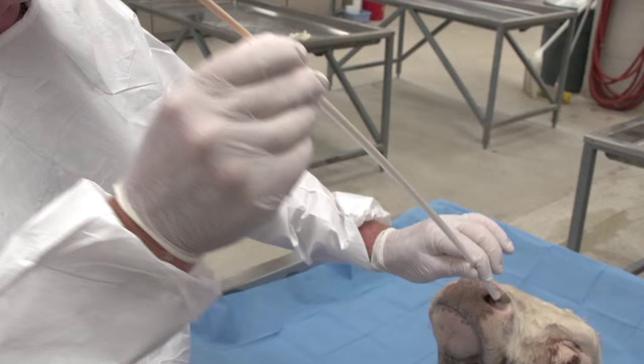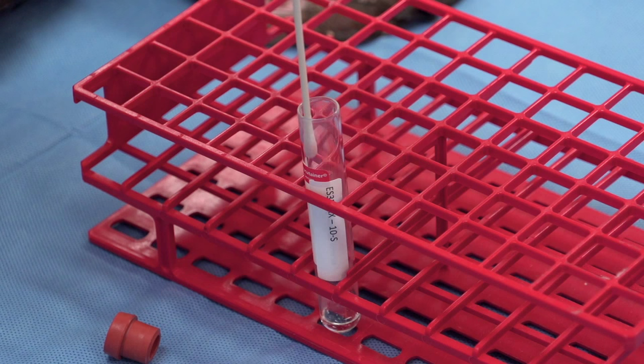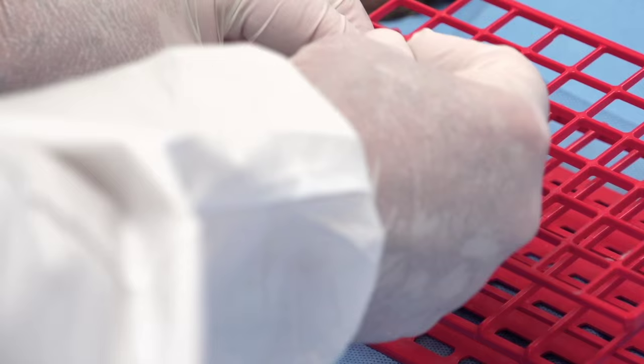Once the sample has been collected, pull the swab back into the guard and remove the entire device. Drop the guard and place the swab in the media container, and cut with the scissors at a length that would allow the cap to be securely fastened.